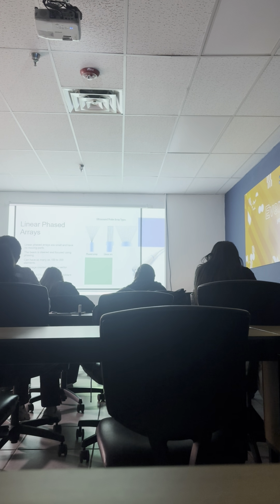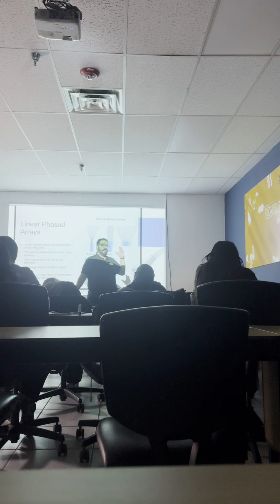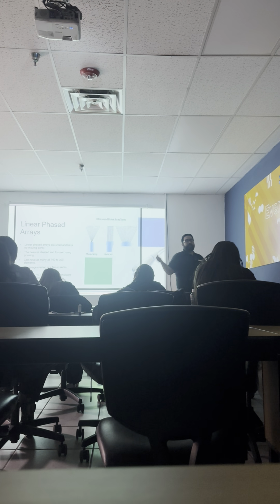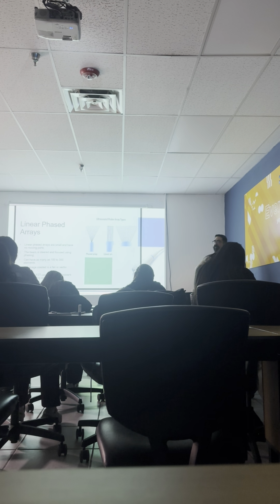If you notice with some modalities, you'll have a dark line, and with some other modalities, you don't. Why is that? The functioning of the crystal. On one setting, that crystal is used, so that's why we get that dark image all the way down. But on another setting, that crystal isn't used, so our image looks fine. That doesn't mean that the crystal gets better and turns off and on. That just means that that crystal is being used for specific types of imaging.